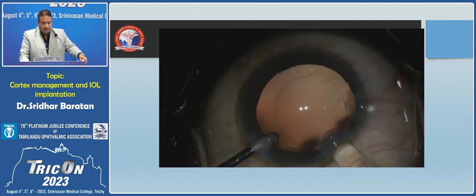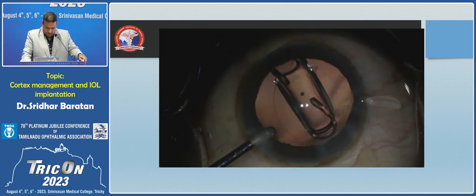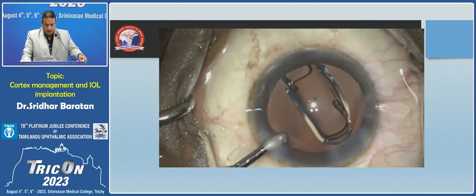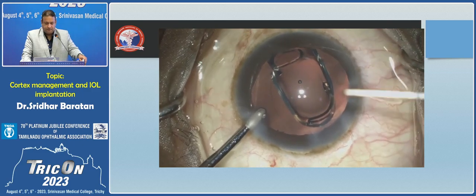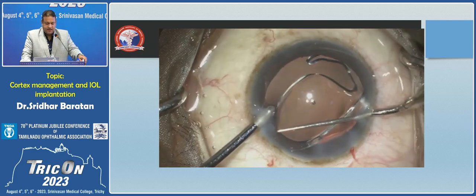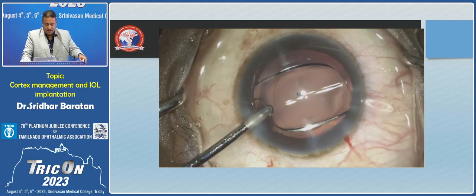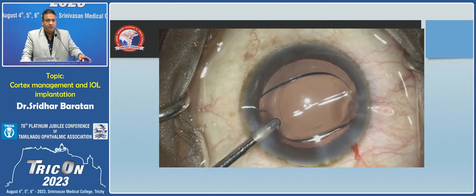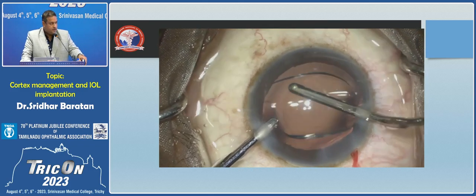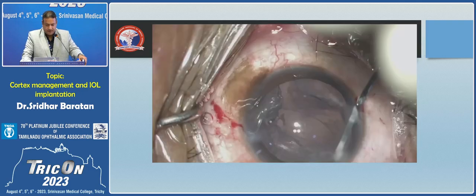And this is the technique that is followed by a lot of surgeons these days, hydroimplantation, where you use the second instrument, your irrigation cannula, to form the anterior chamber, and then you inject the lens in. This has multifold advantages. One is you don't need to inflate the bag with Visco, which then requires removal, and it works beautifully in this case.